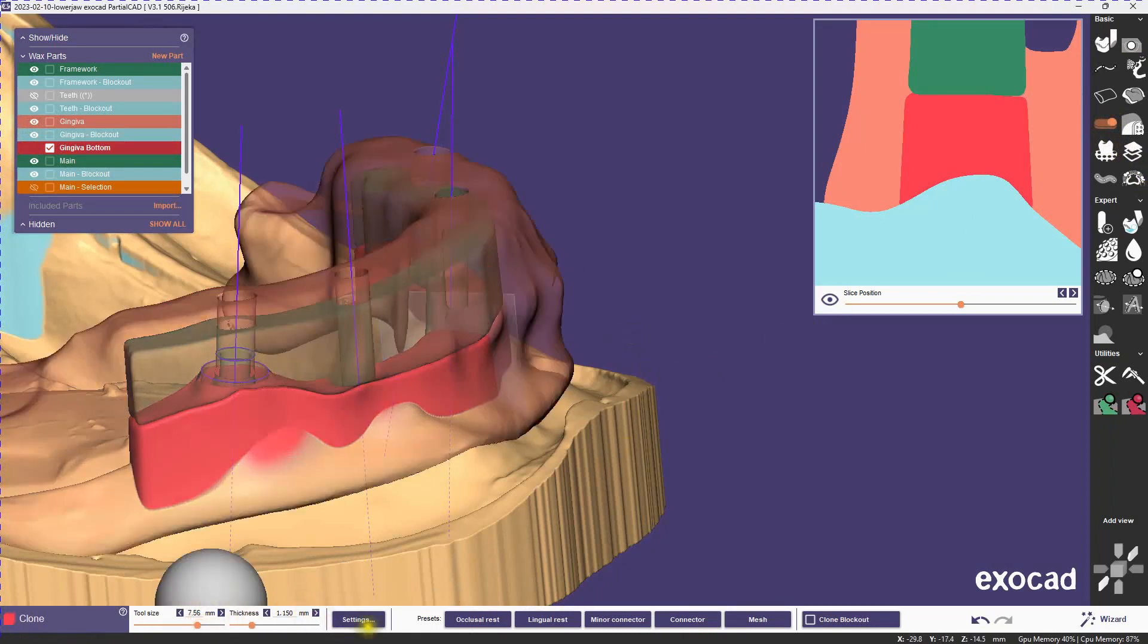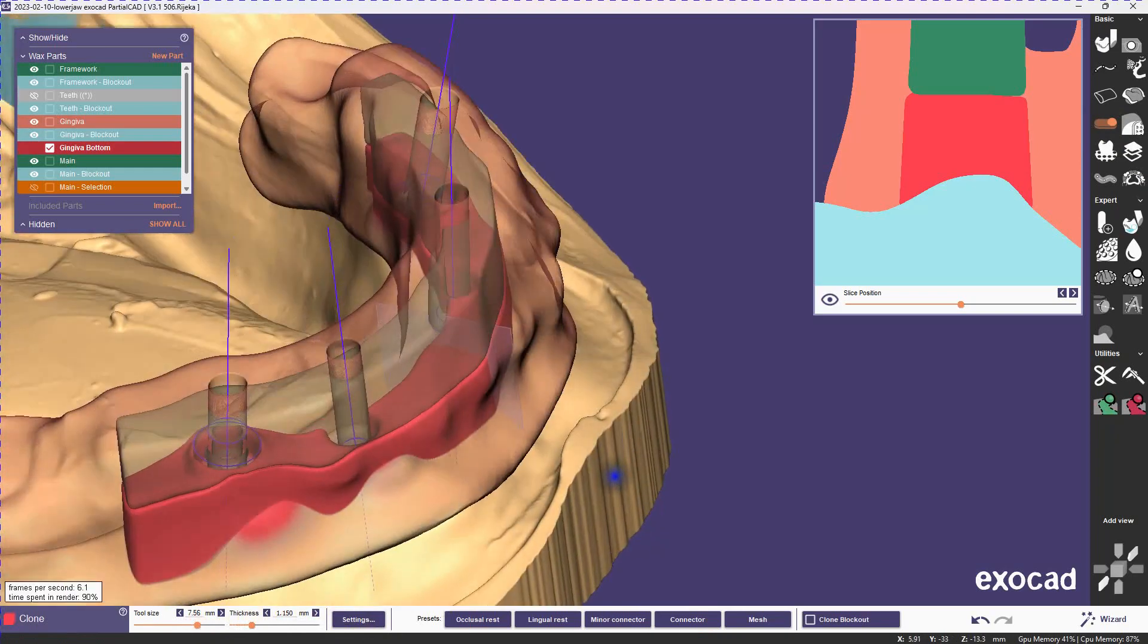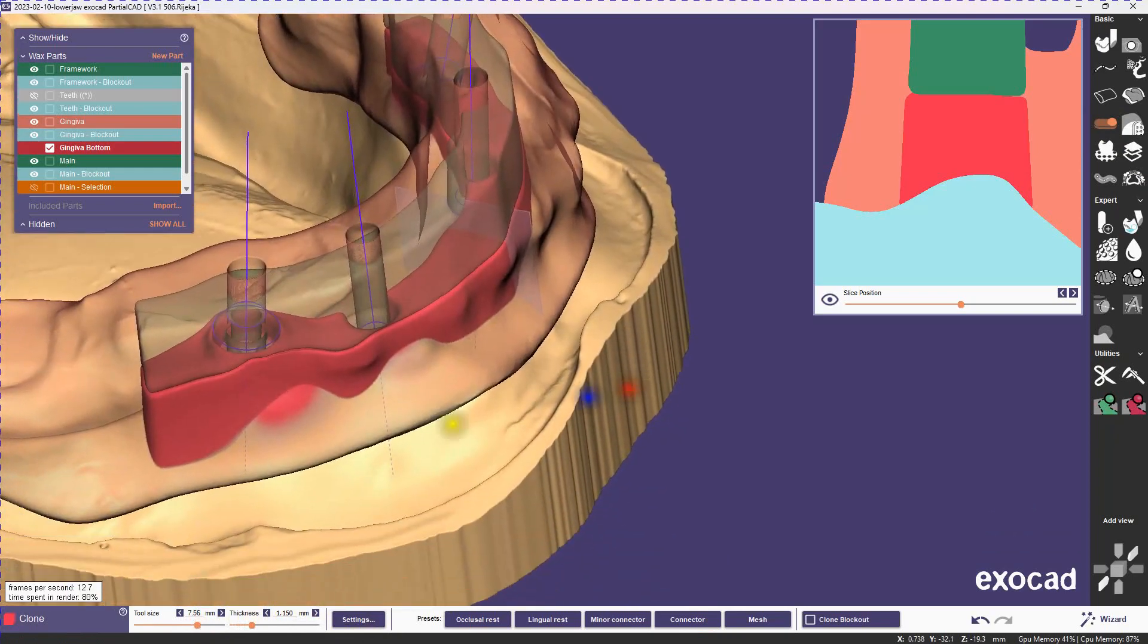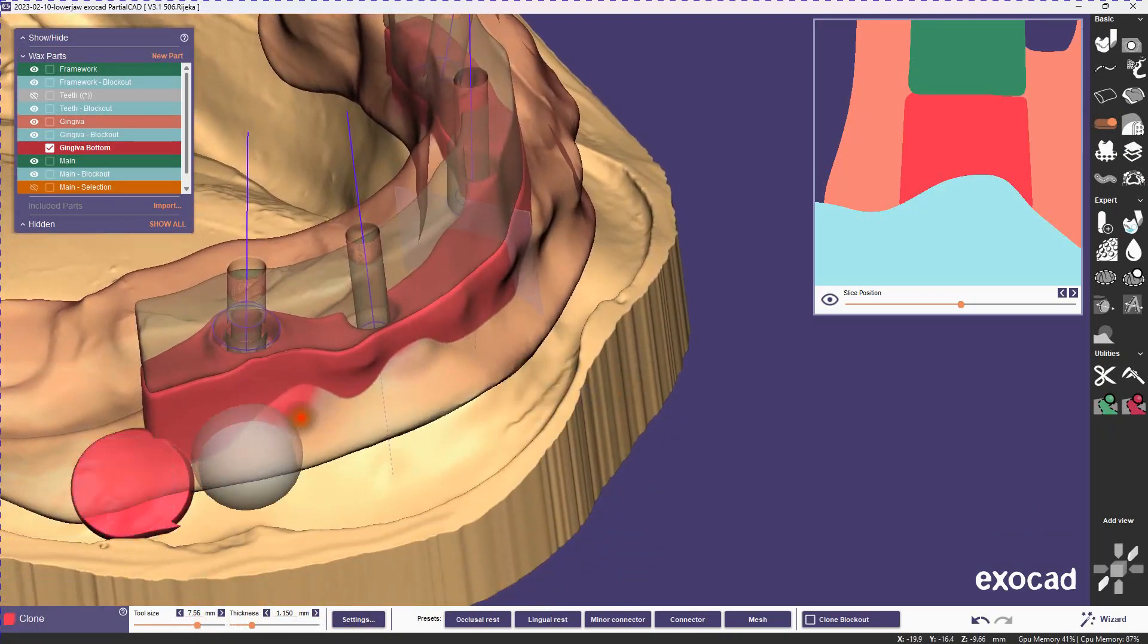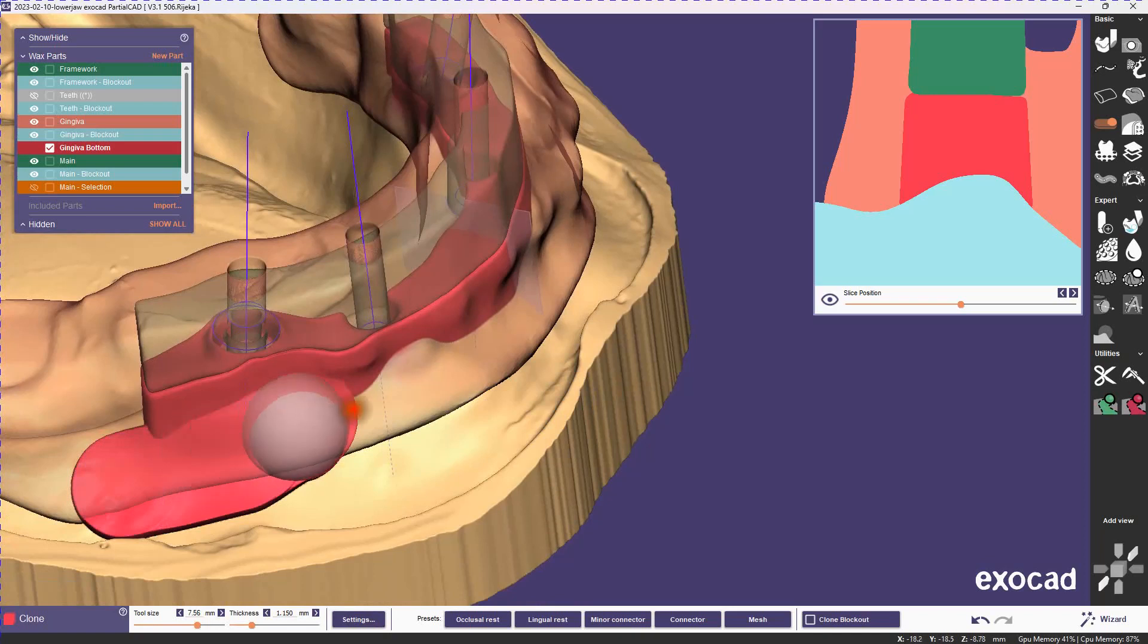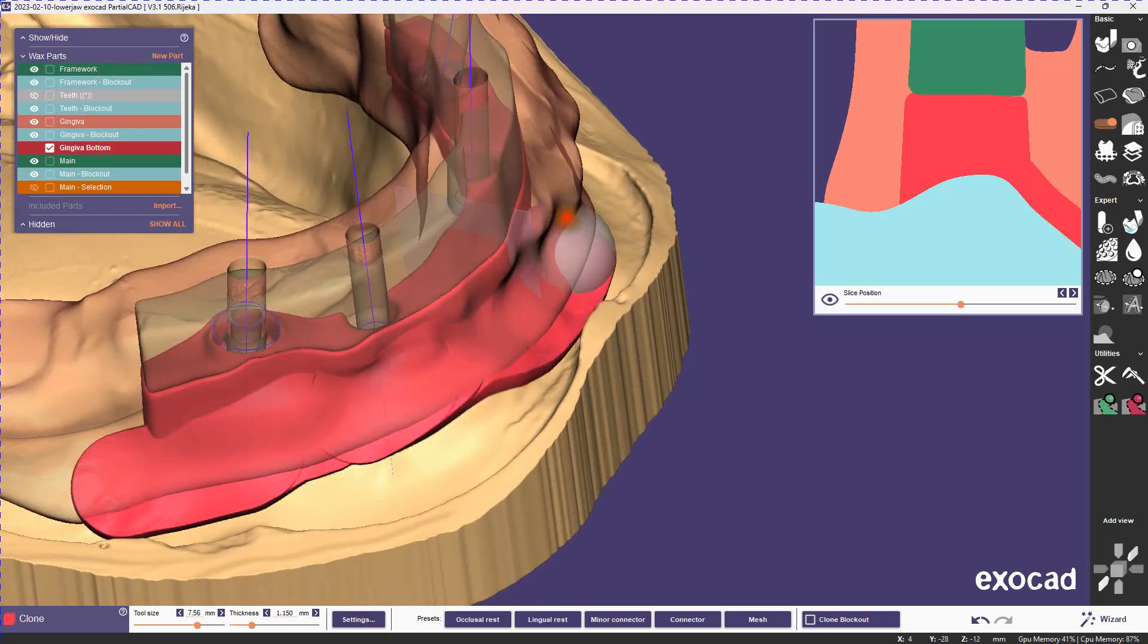So we're going to add a nice base along the entirety of the gingiva, and we're just going to slop on a bunch of wax with the clone tool, and then we're going to trim it back with the crop of the gingiva.